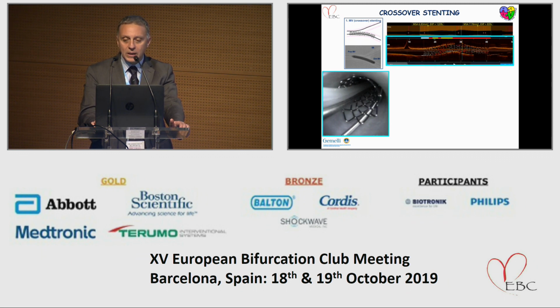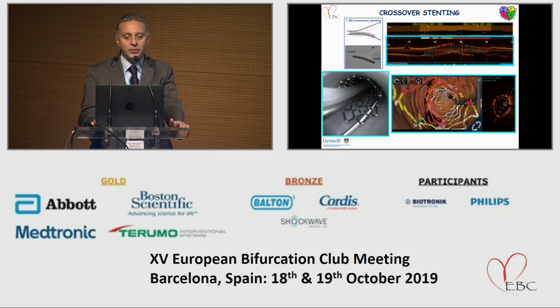And since we like also to understand in 3 dimensions, you see here, this is the proximal part, and you see that there are almost really few white struts. All the other part is hugely malapposed. All of this may be the start of complications in the case you go on with the rewiring.